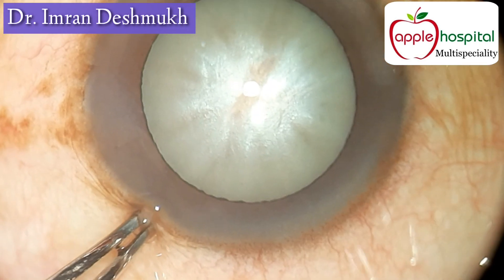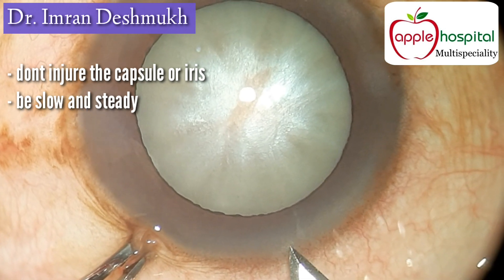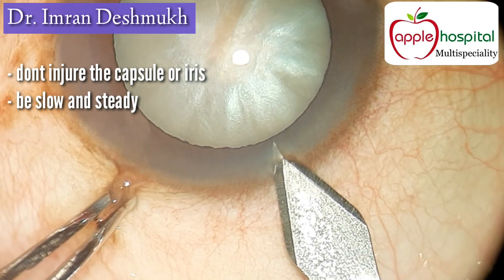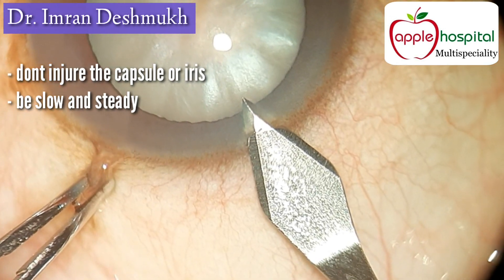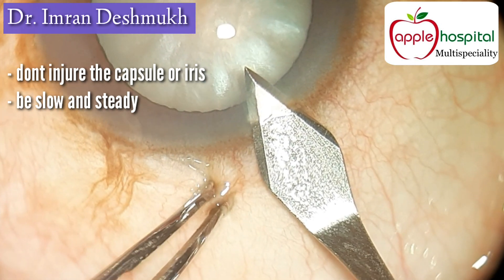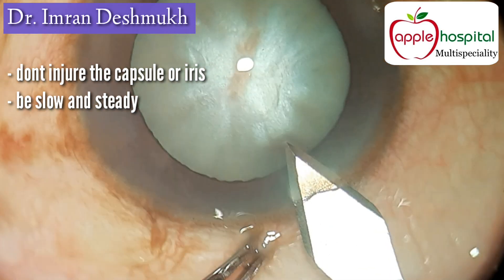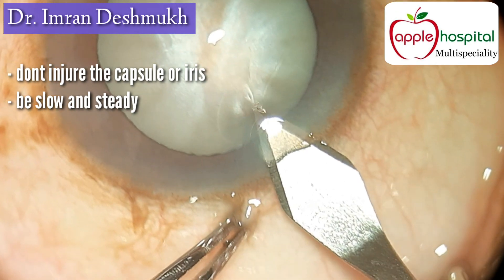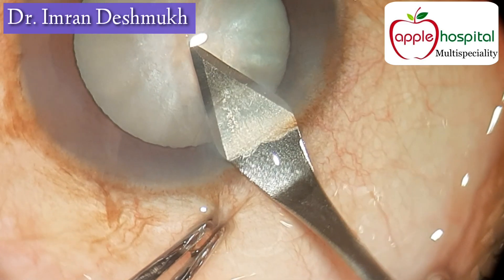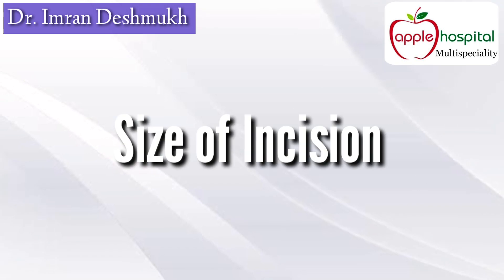In the third case, fix the globe, be slow and steady, take your time. Enter the first plane, then slowly enter the second plane — that is the plane of the cornea. Slowly make a dimple and direct your keratome into the anterior chamber. This direction should be parallel to the plane of the iris. Make sure you don't injure the capsule or the iris — be really slow.